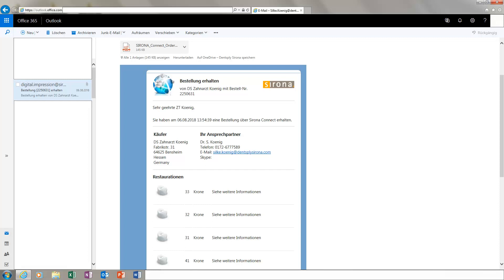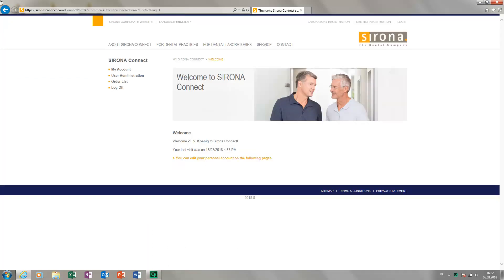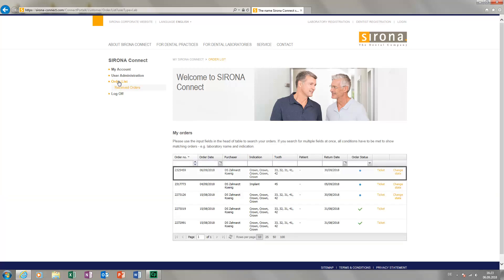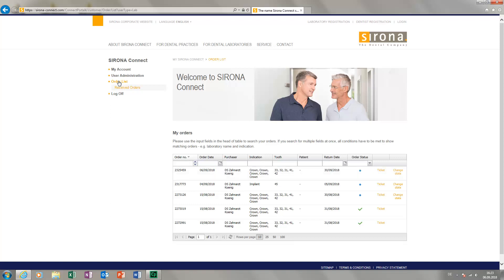To do this, we switch to the SORONA Connect portal. We log in with our laboratory username and password, then we click Order List. This page always displays the most recently received order at the top of the list.